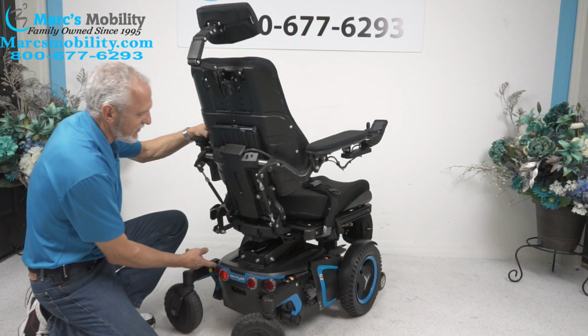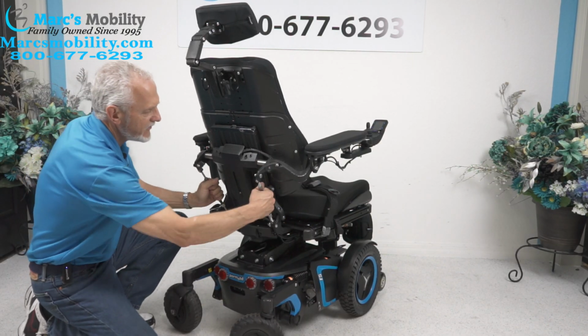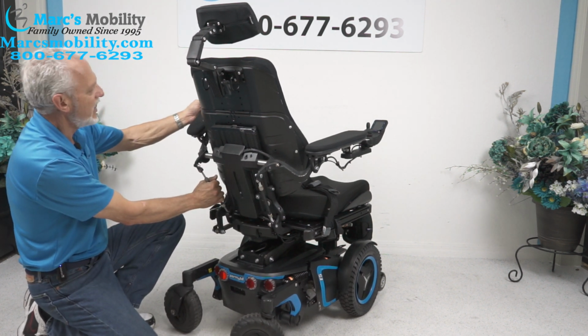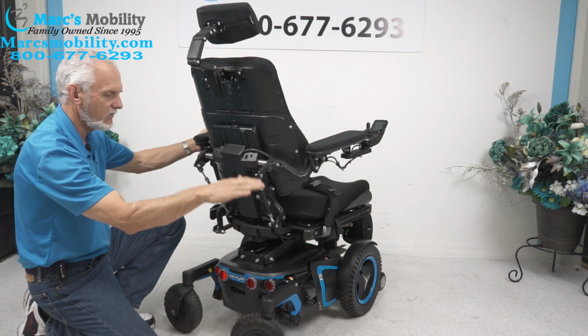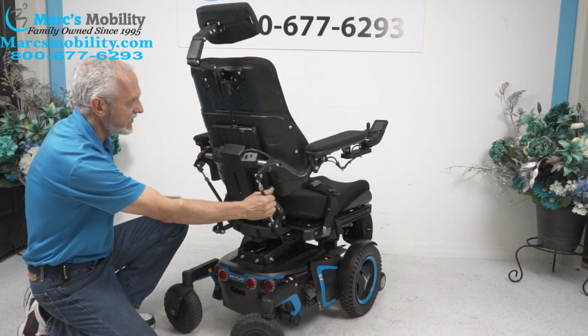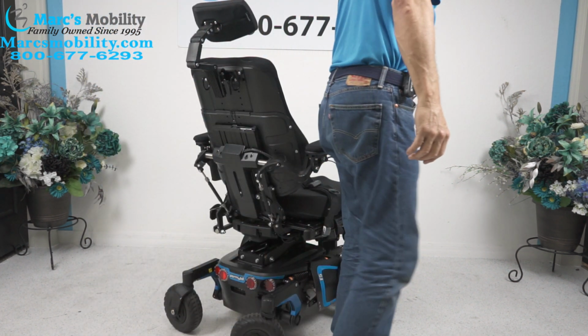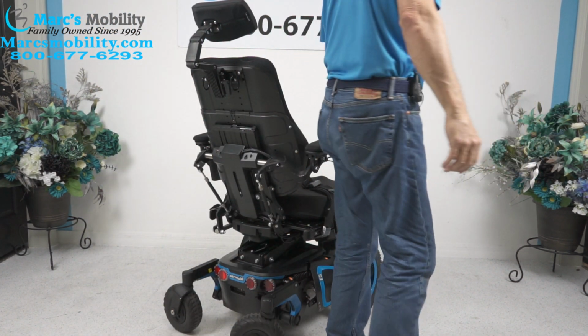These are reflectors, okay? These right here, if you turn this, let me do this one. If you turn this one, your arm will tilt up. So you can adjust the tilt of the arm by turning these cylinders, okay? So let's turn the power back on because I turned the power off over here. I got to turn it back on in front.